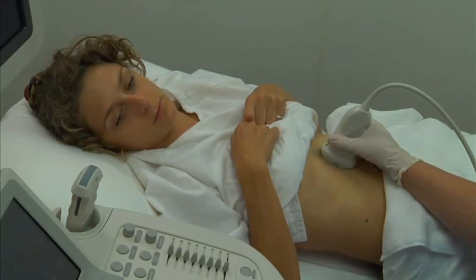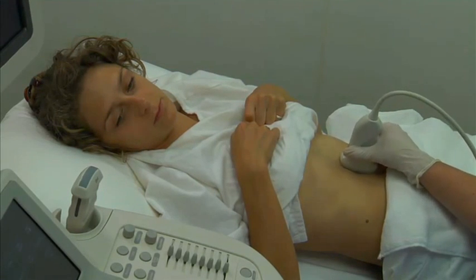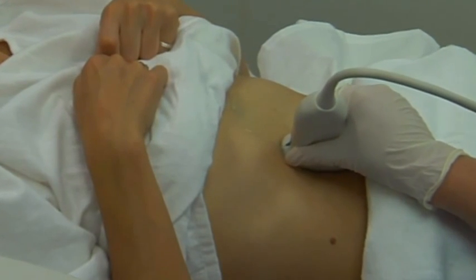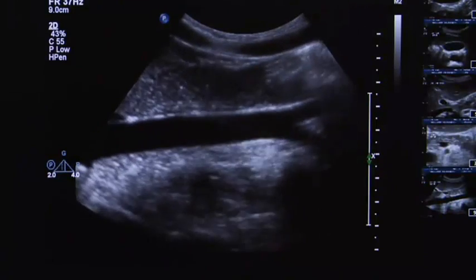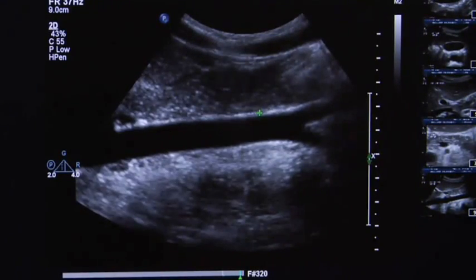Maintaining the longitudinal scan plane, slide the transducer down to the umbilicus. Sweep slightly to the left to obtain an image of the lower aorta, including the bifurcation. Measure the diameter of the distal aorta.